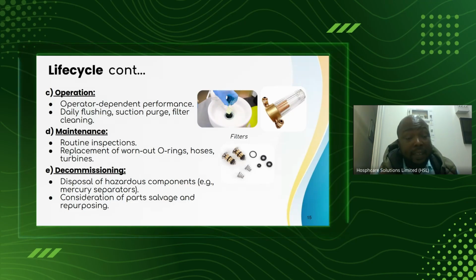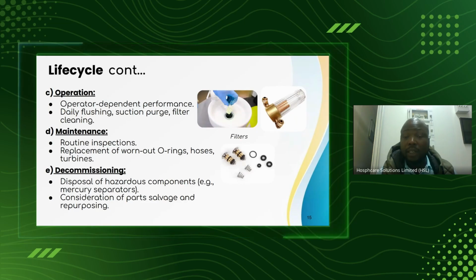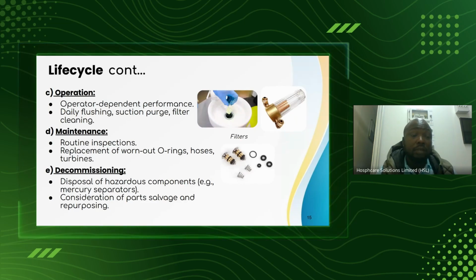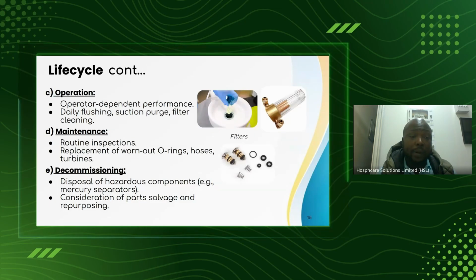In terms of maintenance, we start with the compressor. You need to frequently drain compressors. Remember, once you keep air inside them for long, it condenses back to water. The water inside the compressor lining will react with the compressor lining, forming a sort of weak acid.